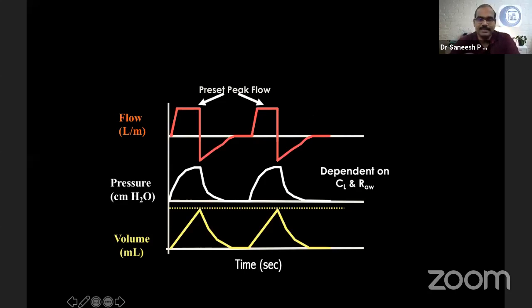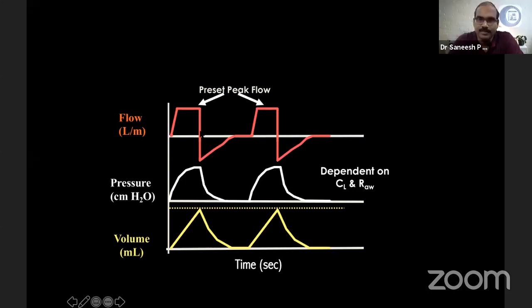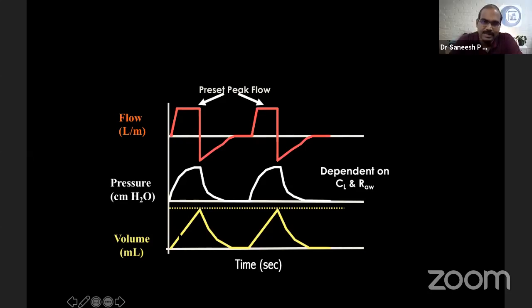Okay, this is the scalar for you. Yes, sir. So can you comment on the breath cycles? Yes, sir. The first graph shows the square, so it's a volume control, but there is no negative pressure in the pressure graph. So it's a mandatory volume control ventilation mode. Mandatory breath. Okay.